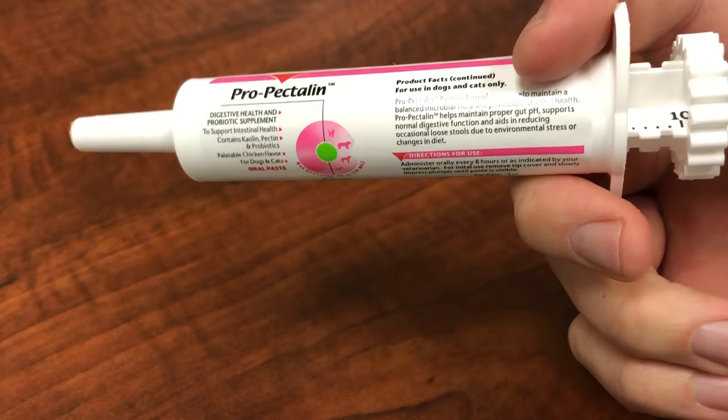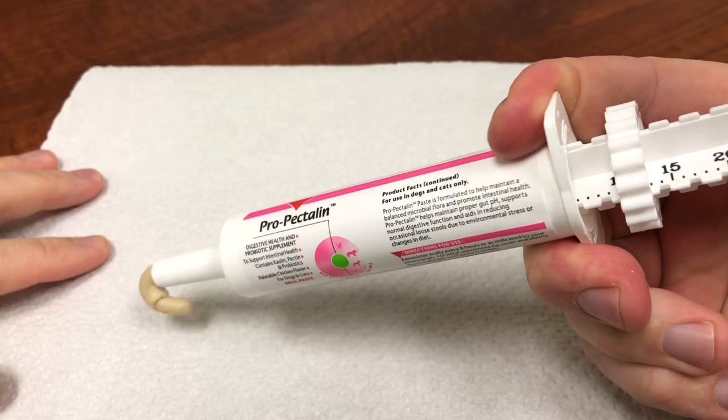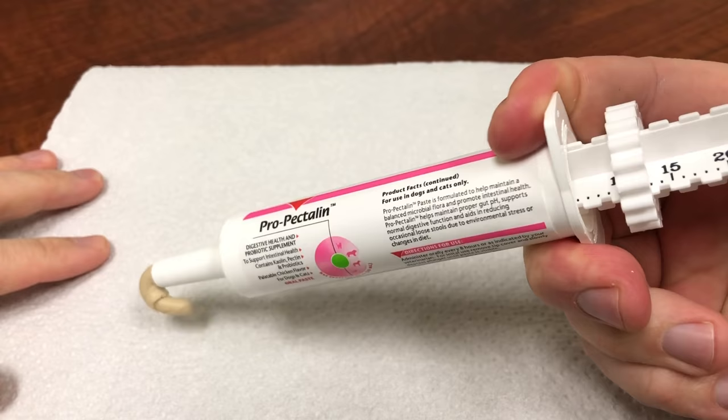Again, remove the cap and depress the plunger all the way down to the end of the syringe until it meets the syringe. Replace the cap and store at room temperature.